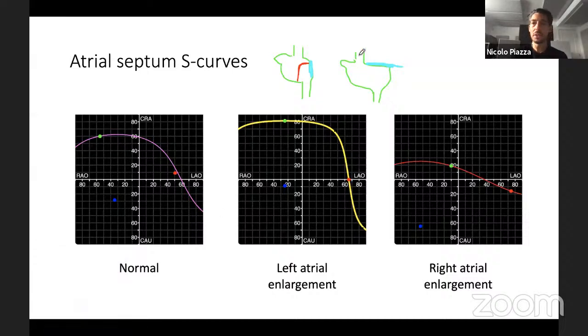You can see that if you come from above with your needle pointing and you try to come down, this is going to be very difficult. So if I ever have horizontal septums, I like to come from below. And if I do come from below, I don't put a big curve. I put a very shallow curve so that I can point more upwards.